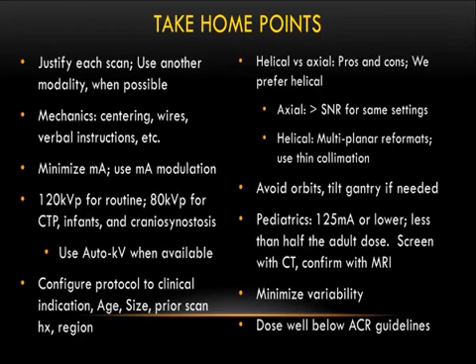On all our portable scanners, so we have a neurological scanner that we take to the patient in the neuro ICU, the CTDIvol there is close to 40, and they are deliberately set low because of that reason. Anytime you're doing a scan for shunt placement, you can do a very low dose scan. Ventriculostomy catheters are visible on chest X-ray or routine X-rays. So if you're looking at the location of the tip, you can really go down on the dose. So these will be some of the examples of where you can really push the dose limit.